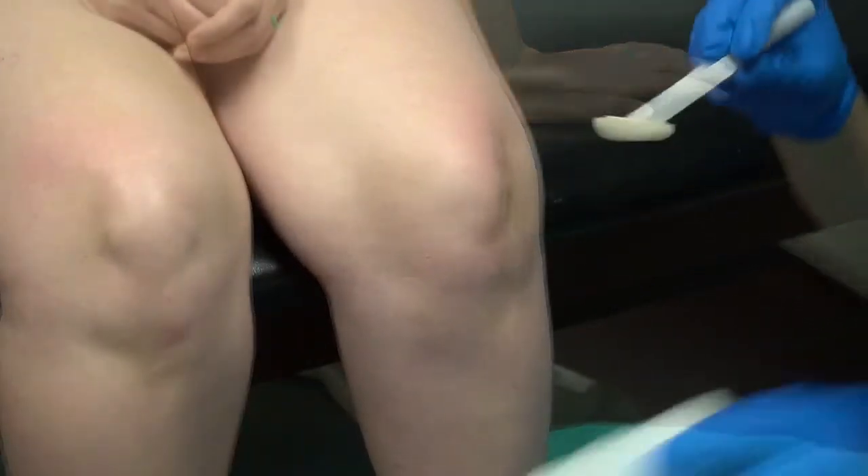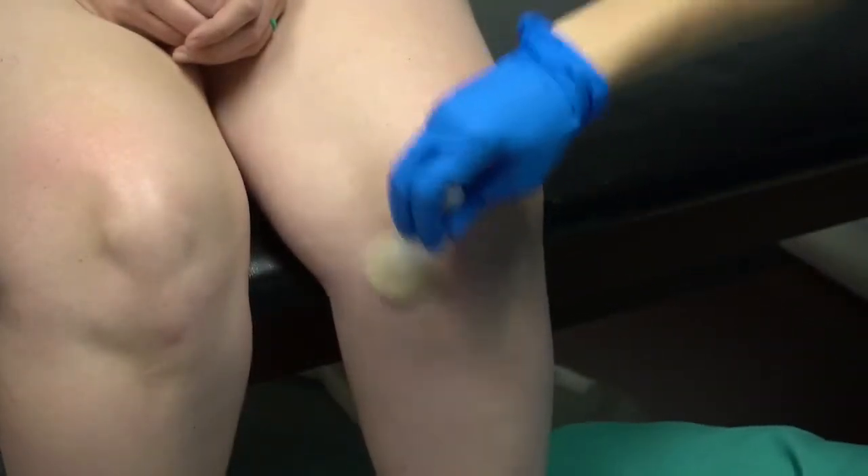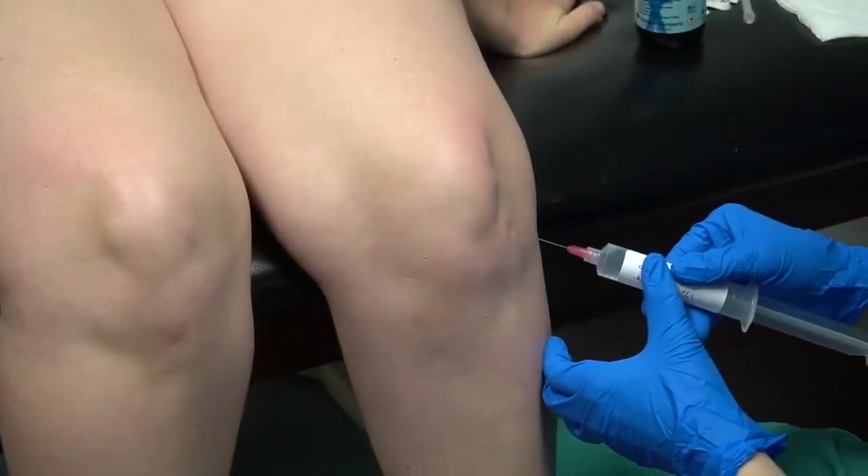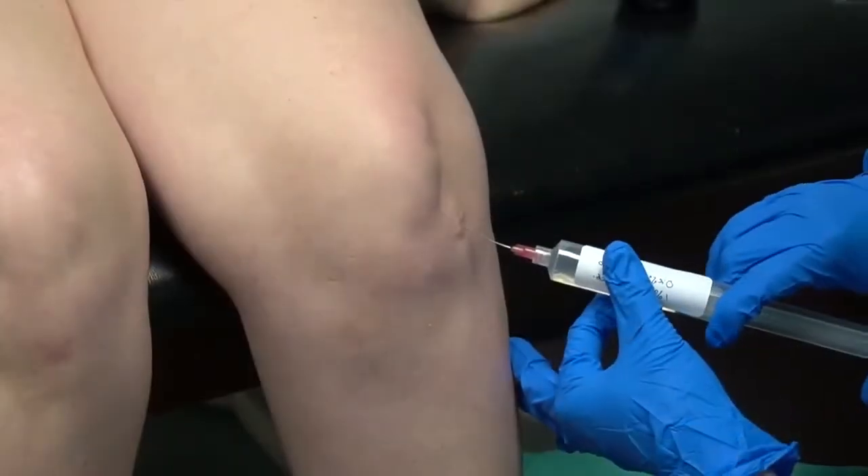Place the patient in either a supine or seated position and sterilely prep the knee. Anesthetize the anterior lateral and anterior medial standard portal sites with approximately 15 cc's of anesthetic, creating a wheal.